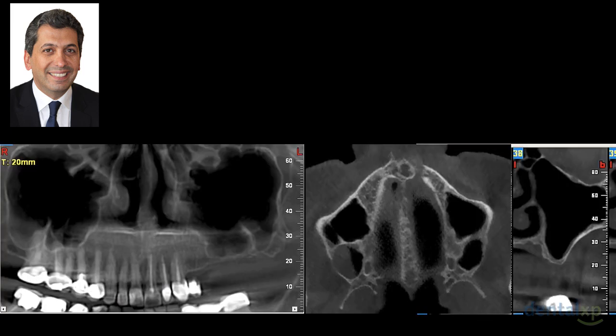I will show you a clinical case to understand this technique a little bit more. You can see this sinus, the left maxillary sinus. We have a septum, a very high septum. But in these cases, when the septum is that high, we can consider that we have two different sinuses. You can see here on this cut that we have one sinus in the anterior part and another compartment in the posterior part. Since we need to graft this premolar region and this molar region, we don't have to graft this part of the sinus, so it will be easier for us to only fill the anterior part of this sinus that is divided by the septum.